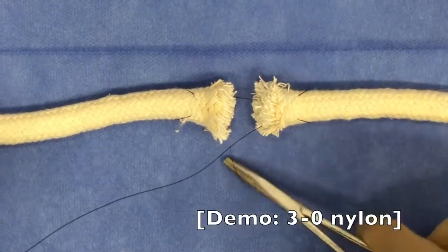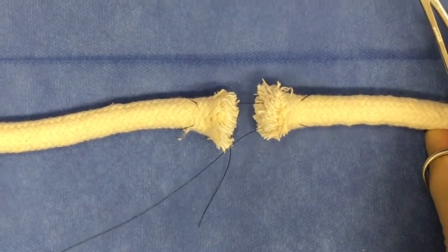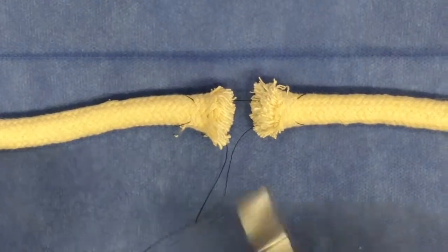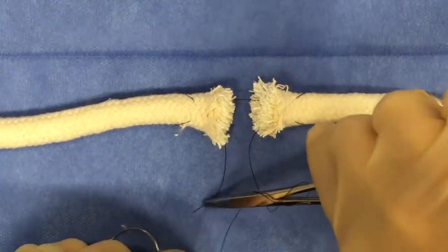Please note, in this demo video only, I'm using a 3/0 nylon suture, and that's just because it provides good contrast against the background as seen here. A 3/0 or 4/0 size suture is appropriate depending on the tendon size.